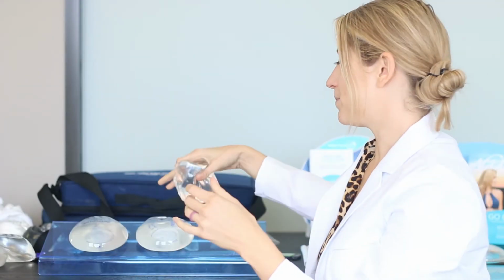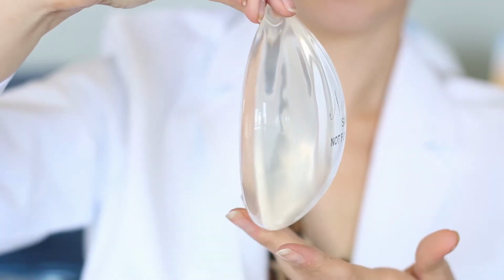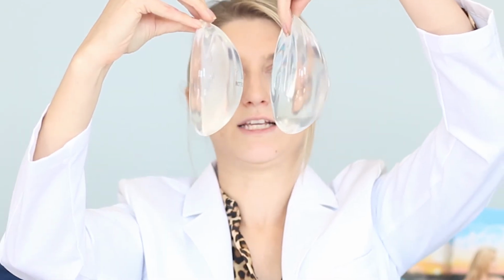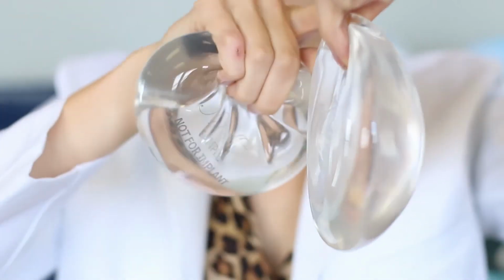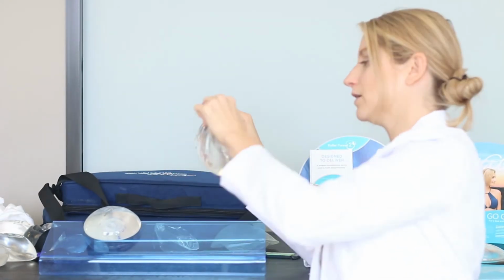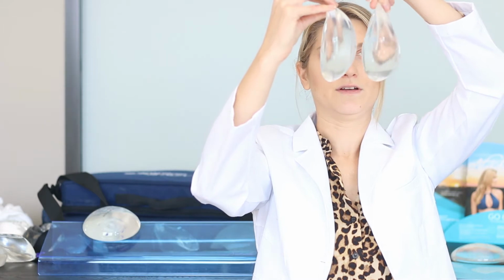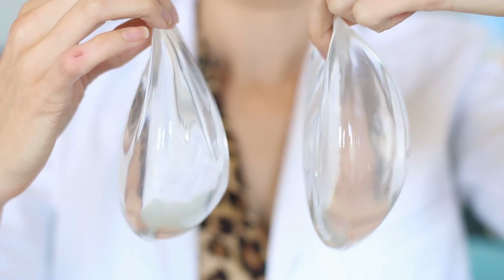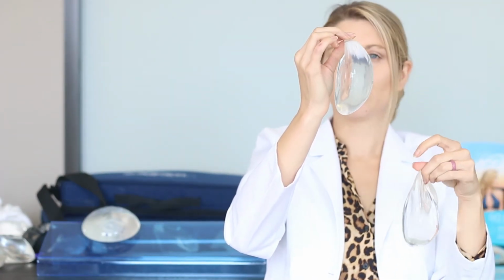The third step up is the cohesive. So you can see this whenever I hold it up, that's a very, very round look, versus this one right here, which has just a little bit of rippling, a little bit of teardrop that is still there, versus that one that's completely round. And so you can really tell the difference between the responsive and the cohesive. That one's much more of a teardrop shape, a little bit more rippling. And this one basically has a very round shape with very, very little rippling.